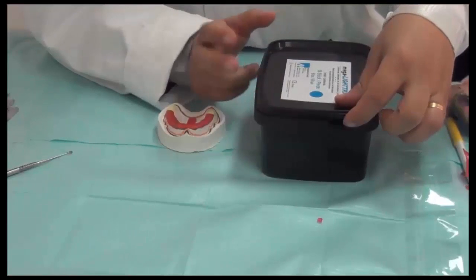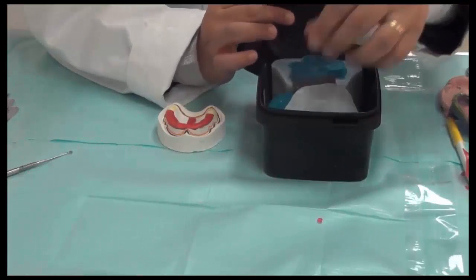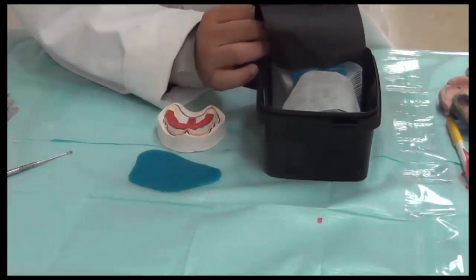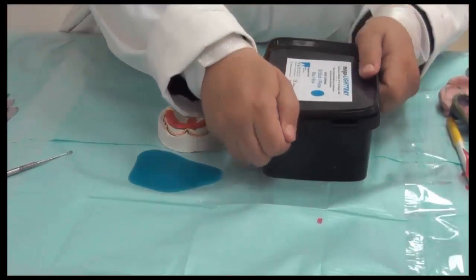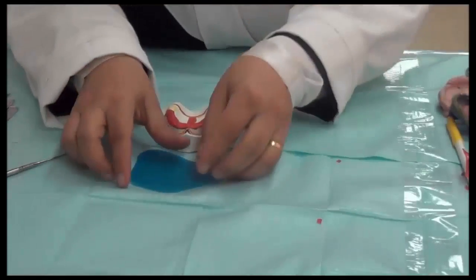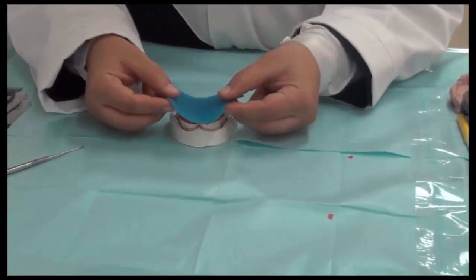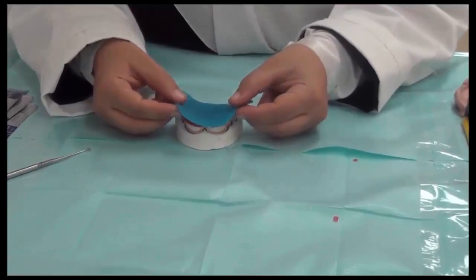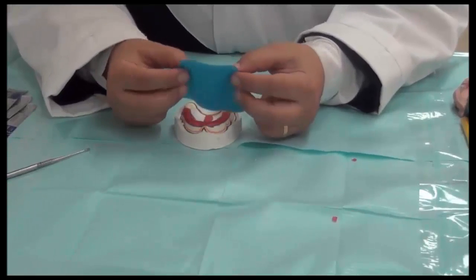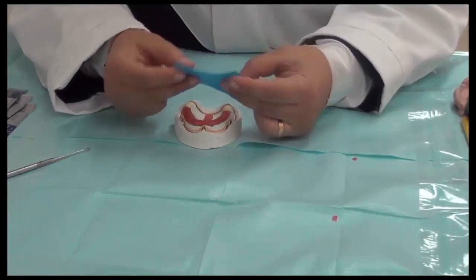Light cure material comes in a light proof box, and this is also sealed with multiple sheets to protect it. So this is called light cure material. We make sure the box is sealed, and the sheet we get comes in a shape that corresponds with the shapes of most casts. So it has this oval form where anterior, posterior edges are there. It also has uniform thickness. So although it's like a dough, it has a uniform thickness throughout.